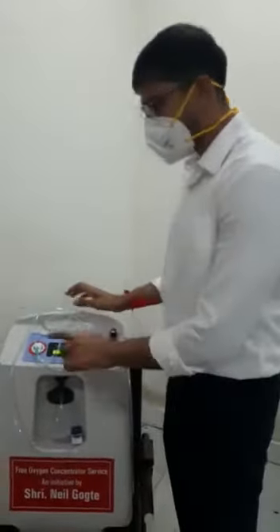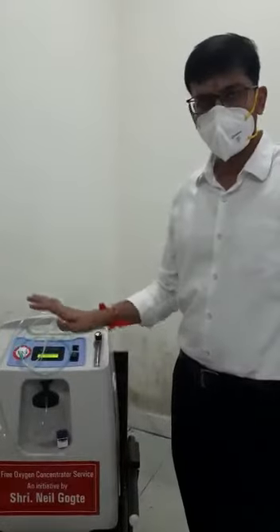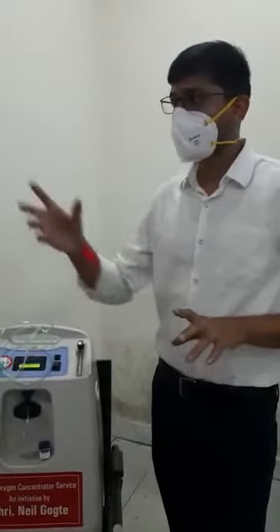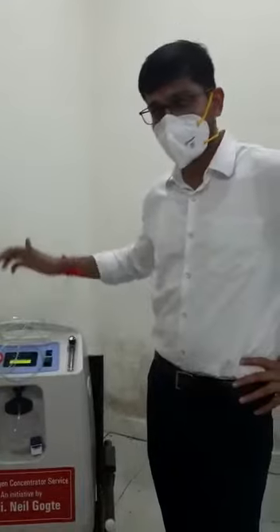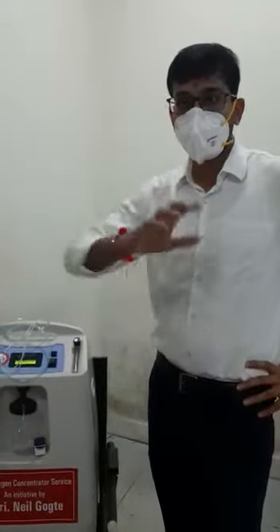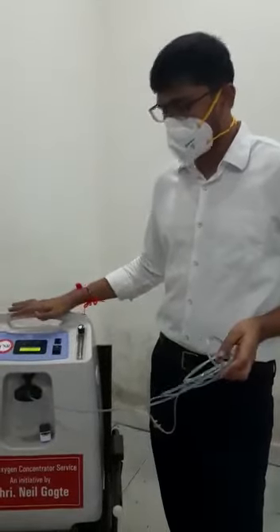Always make sure you are not around an area where there is fire, because there is a fire hazard with oxygen. Make sure there is no fire near the area, and make sure it is not a very closed room — the room should be well ventilated. Only then will this machine take oxygen from the air, concentrating the air to almost 90 to 95 percent oxygen by removing the nitrogen part.